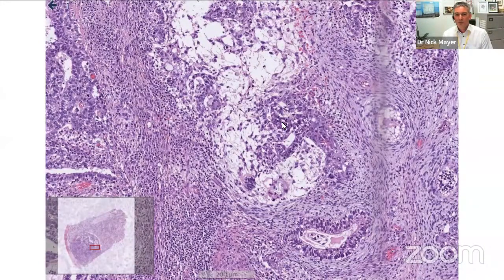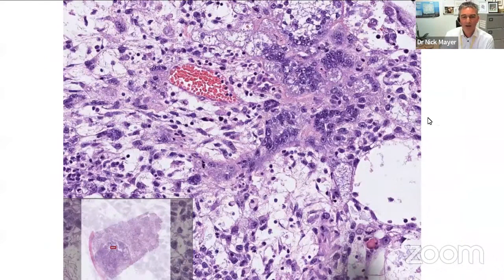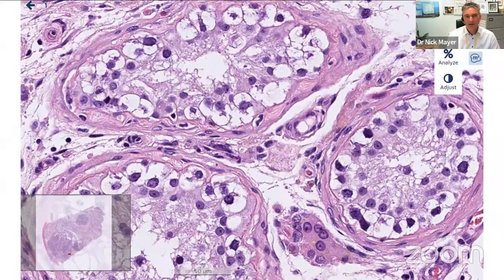In other areas of the tumor, in addition to these 2 other elements I've mentioned already, there were some teratomatous looking glands. There weren't that many of them. There were some multinucleated syncytial trophoblastic cells as well, but without the bilaminar appearance of choriocarcinoma, just with the syncytial trophoblastic cells. And there was also in the background testis a bit of germ cell neoplasia in situ as well.